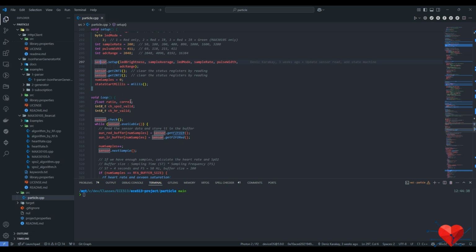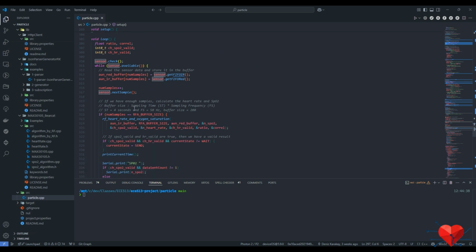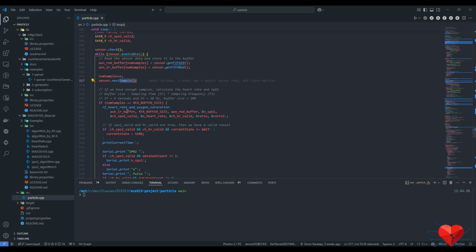And in the loop code, this is running always. We are retrieving the sensor data using sensor available. We are checking, and we are getting each sample. So in here, after many trials, we determined the best timing for clear and less noisy data. We are using a buffer size, which is sampling time times sampling frequency. After our trials, we determined 4 seconds as the best sampling time and 50 hertz for the sampling frequency, which gives us clear, less noisy, and as accurate as possible data.